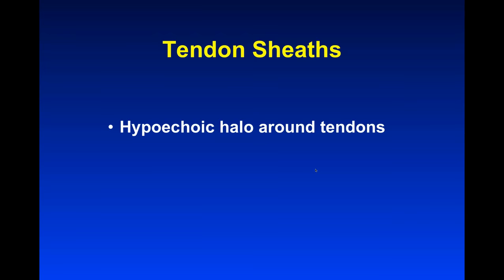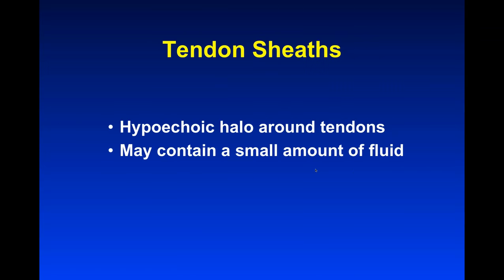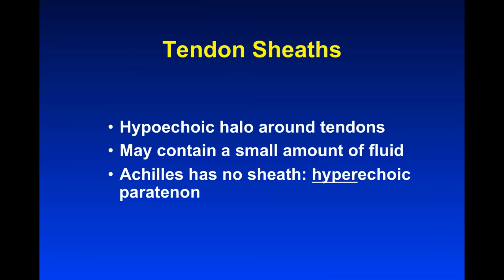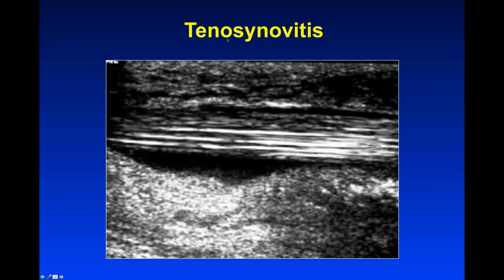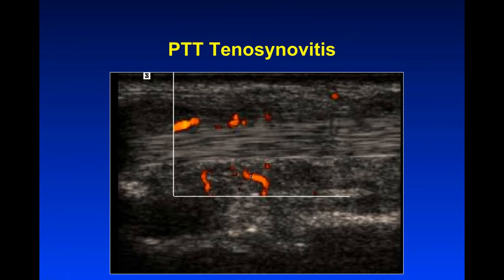Now tendon sheaths — their job is to lubricate the motion of tendons. They appear as a hypoechoic halo around tendons and may contain a small amount of fluid. Some tendons have no sheaths, most notably the Achilles, which instead has a hyperechoic paratenon. Here's an example of tenosynovitis, inflammation of the tendon sheath, at the posterior tibial tendon in the ankle. The fibrillar pattern is slightly hypoechoic but the main abnormality is too much fluid both in front of and behind the tendon. Putting on Doppler shows flow mostly around the tendon — that is tenosynovitis, and in this case it is in fact inflammation, which is why we say itis, and it can be quite painful.